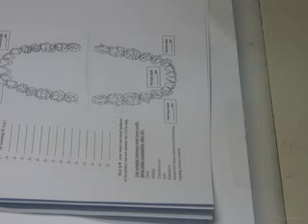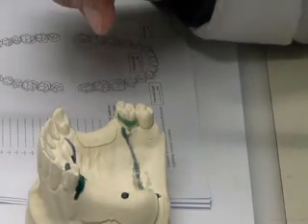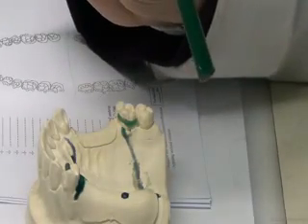design. So what are the steps we do before designing? What is the first step we talked about? Yes, I got a cast, the patient came and I took an impression. This is the cast there. Okay, what we are going to do to this cast? Survey. Okay, one of the steps is surveying. This is an initial step.